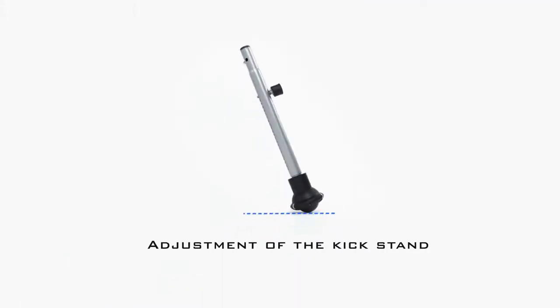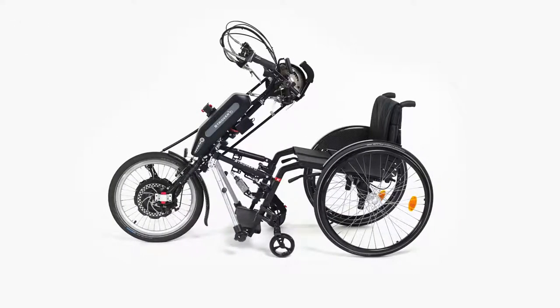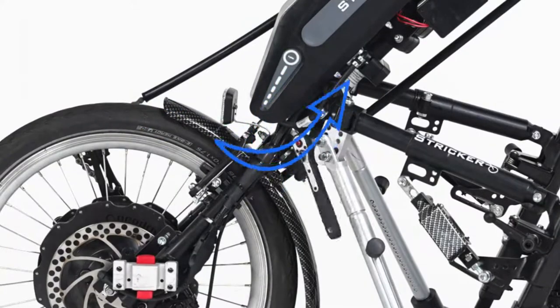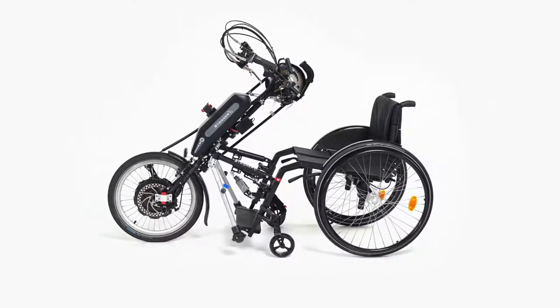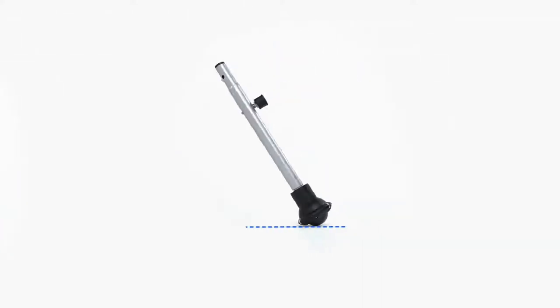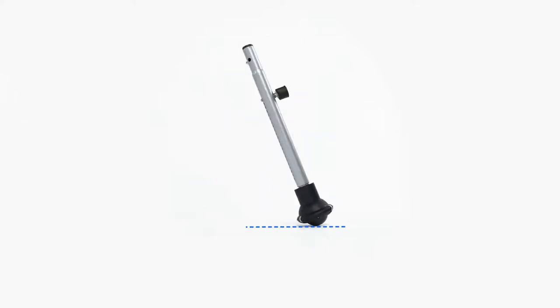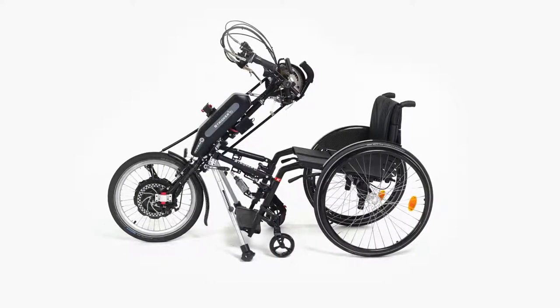Next, adjust the kickstand so that the reconnection process after uncoupling the wheelchair is as comfortable as possible. To do this, the front wheels of the wheelchair must be on the ground. First open the two screws on the kickstand joint and place the stands parallel to each other, then adjust the length of the stand. When using kickstands with roller balls, make sure that only the ball is on the ground and not the frame. If necessary, change the inclination and tighten the screws.